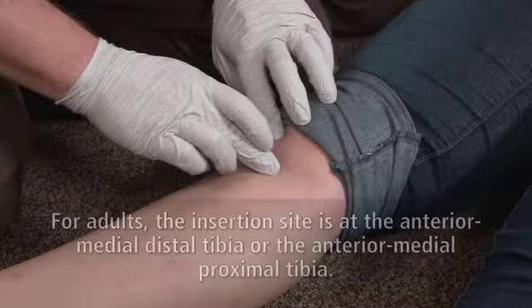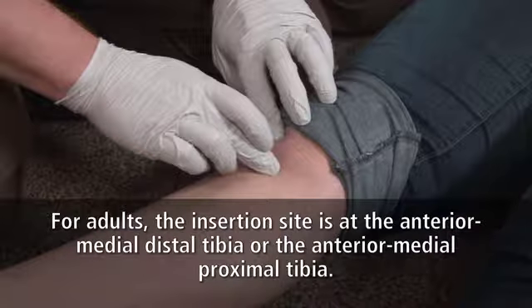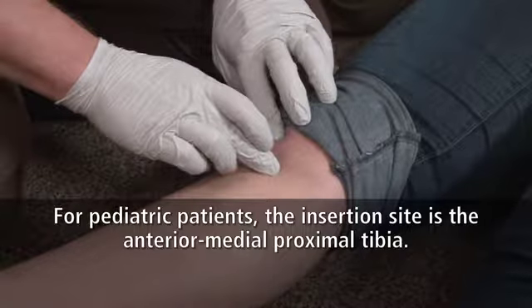For tibial insertion in adult patients, the insertion site is usually located at the anterior medial distal tibia or anterior medial proximal tibia. For pediatric patients, the insertion site is the anterior medial proximal tibia just below the tibial tuberosity.